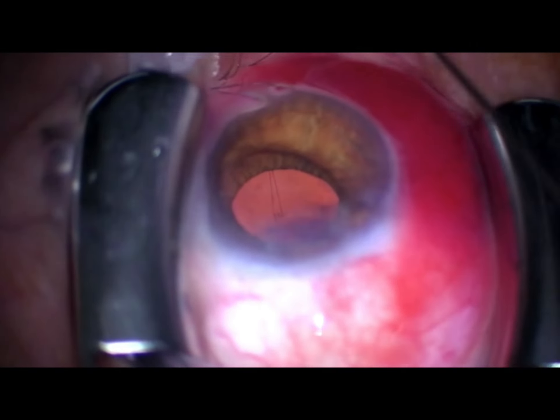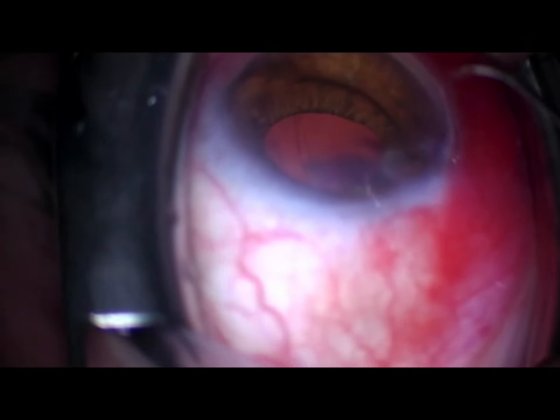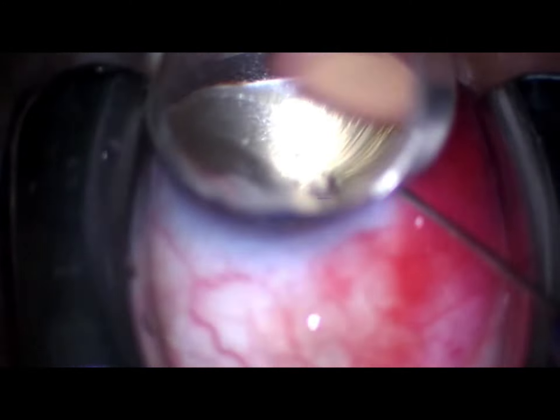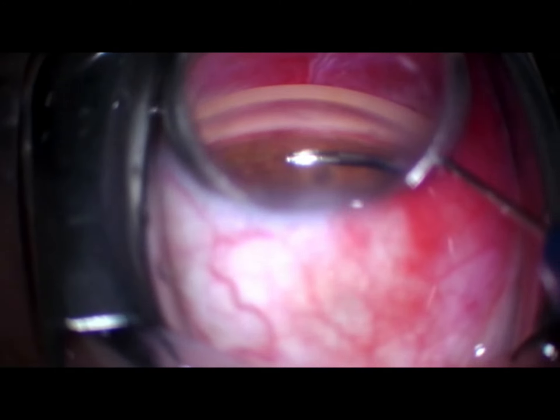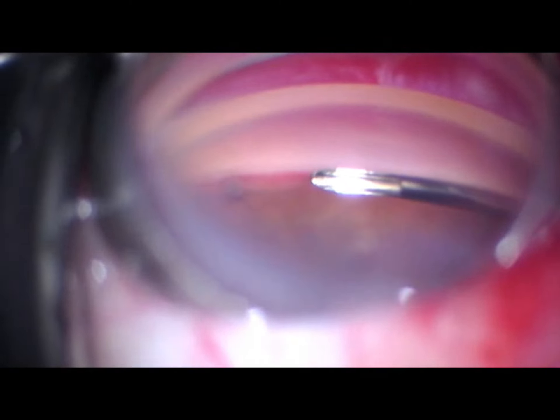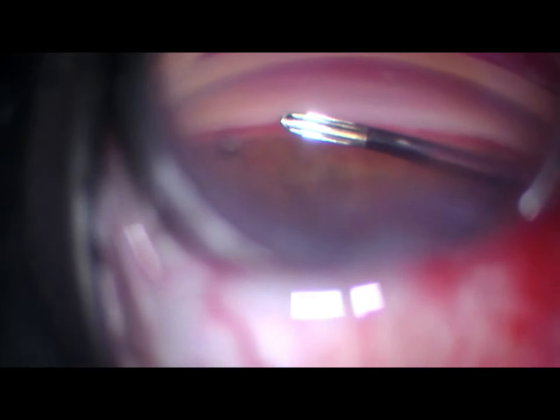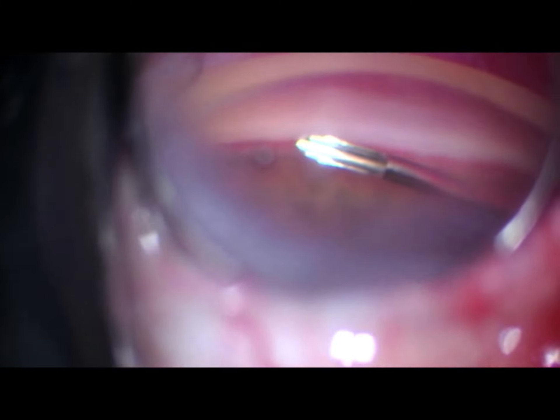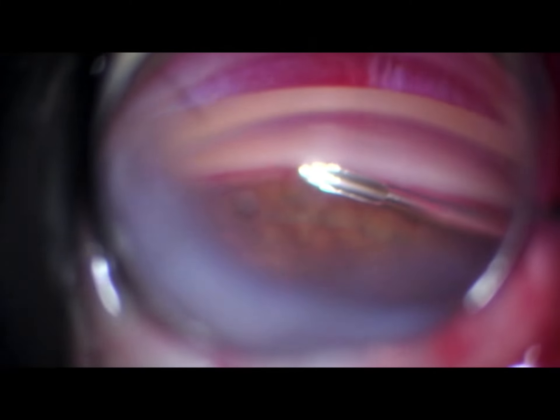I test the Hydrus device. I like a posterior direction insertion, and then I turn it back around. Now I'm going to focus on the tip and then push my focus point further towards the meshwork as I advance the Hydrus instrument towards the meshwork, making sure I'm right on target.